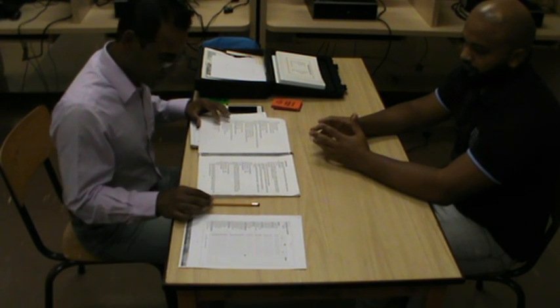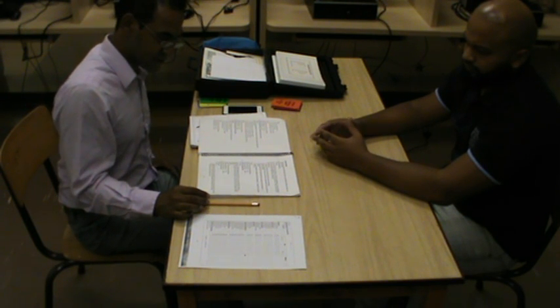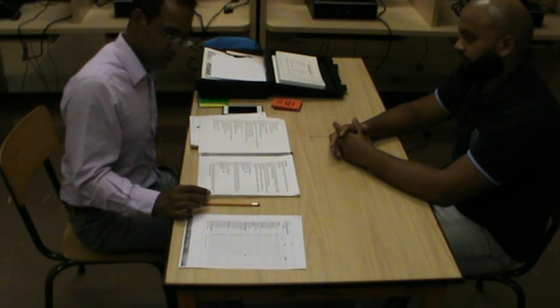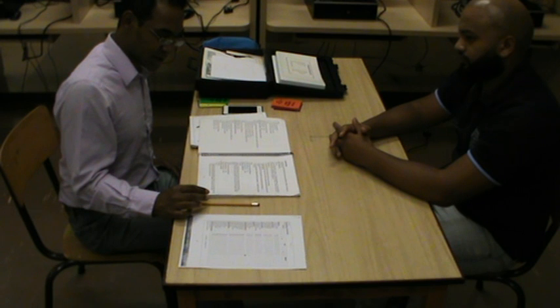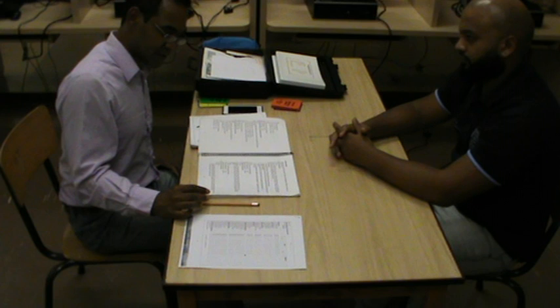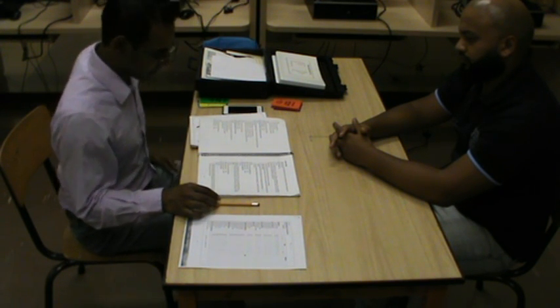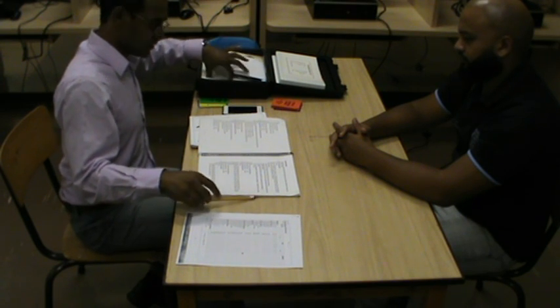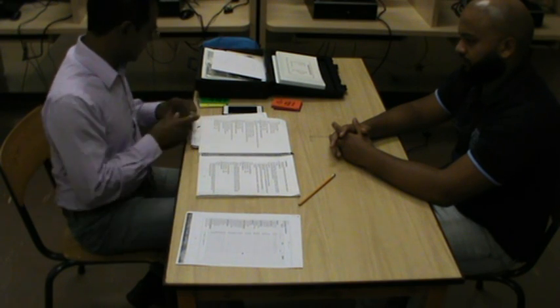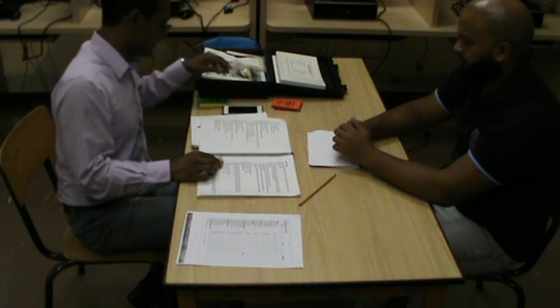And students, for this section, the examiner shows the client the following objects: a comb, a scissor, a paper, and an envelope. What we do here is ask the client, show me how you use these objects. Right? For the use of the pencil and eraser, the examiner can say, draw a line on the paper and then erase it. So here I'm going to show the client a pencil, and he can, with the piece of paper, actually imitate drawing a line.